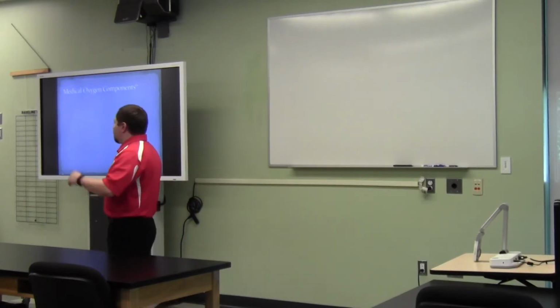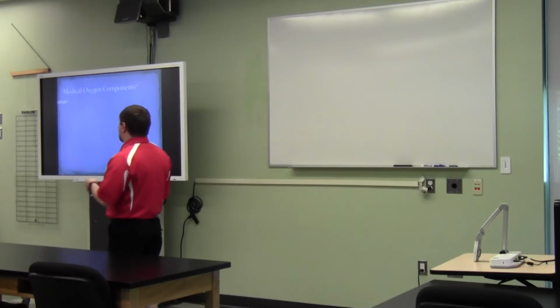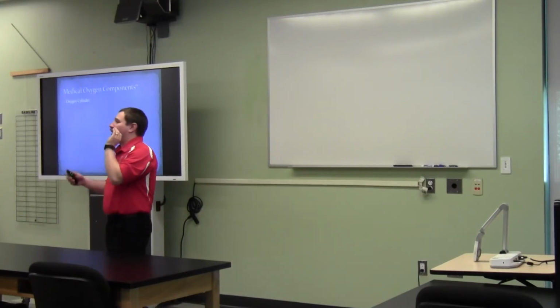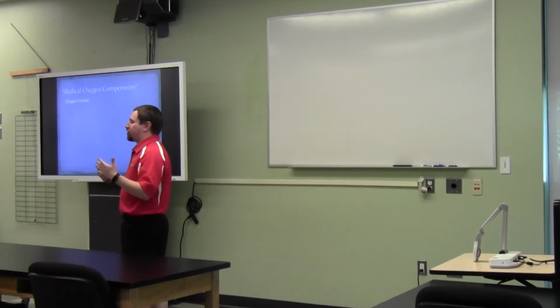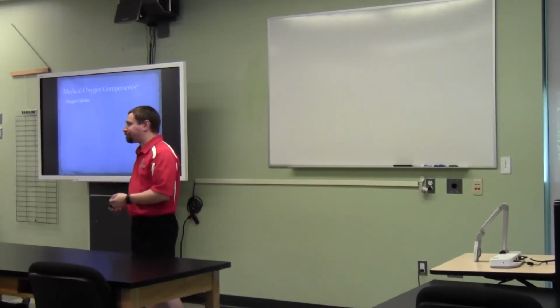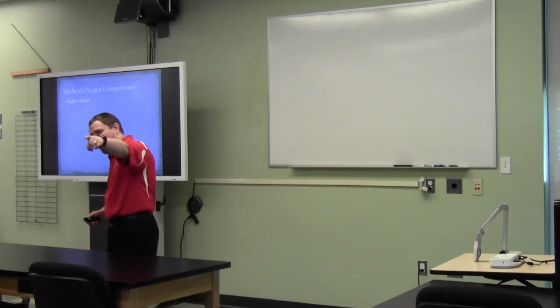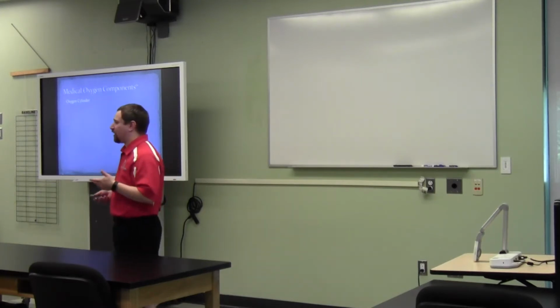Okay. So if we're going to give oxygen to a patient, how are we going to do that? Well, there's a couple of different ways we can go about it. Pretty much in the pre-hospital setting we are going to be using oxygen cylinders, and they're usually named for their size, with letters that designate their size. The tank we have in the back over there, and we'll get to play around with, is a D cylinder. It's pretty much the workhorse of pre-hospital care, at least for EMTs.